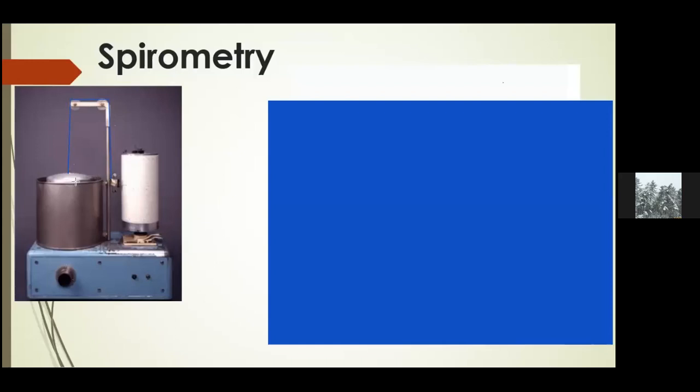So what happens is that at this juncture here, this is the point where you are going to insert the tube that is coming from your mouthpiece.